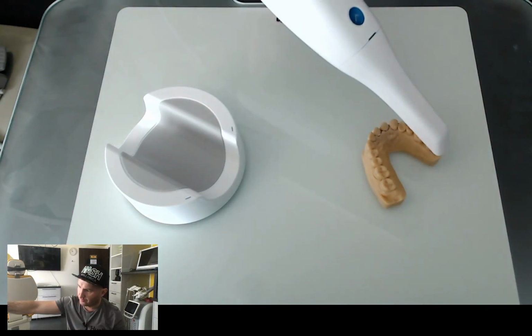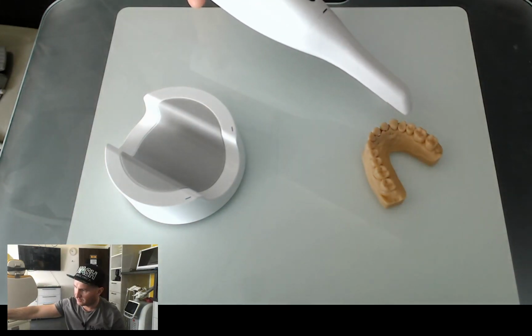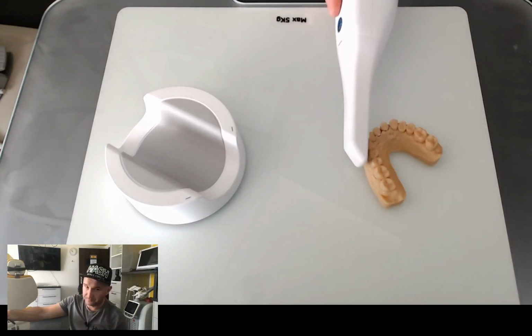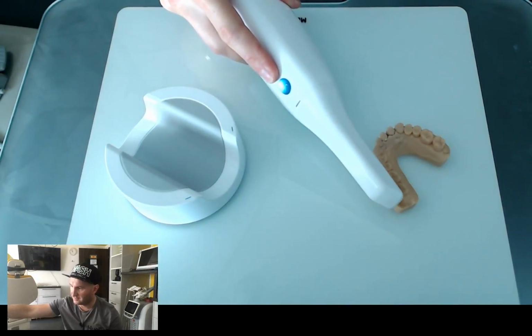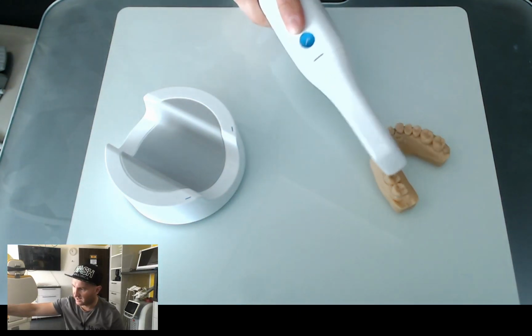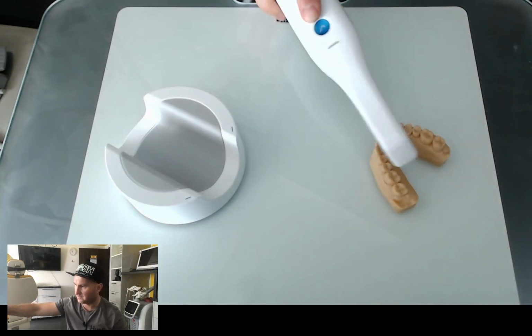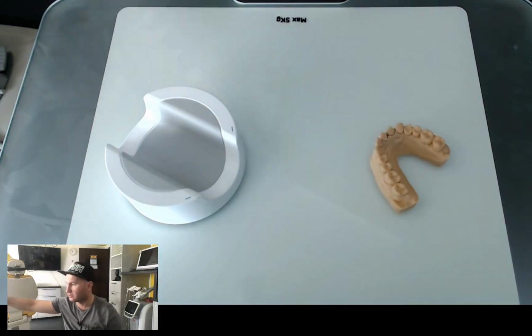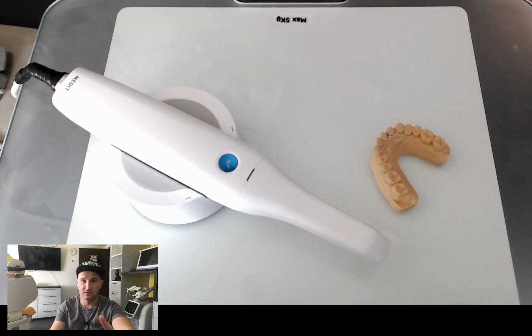Then you go on the labial surfaces. In the middle you need to stop scanning and switch direction of the scanner and finish your scan. And after that you just go with your details and show the scanned area to your scanner from different directions to get the most accurate scanning image. This is the first important thing.